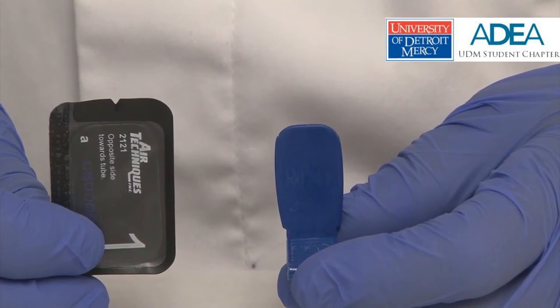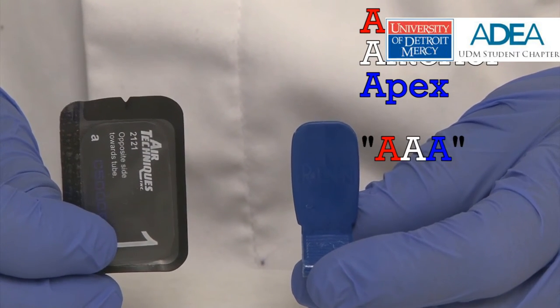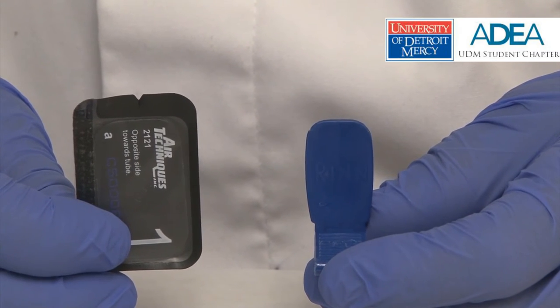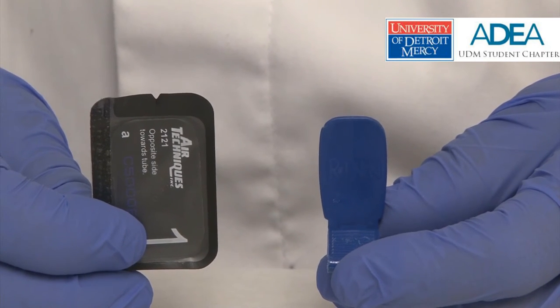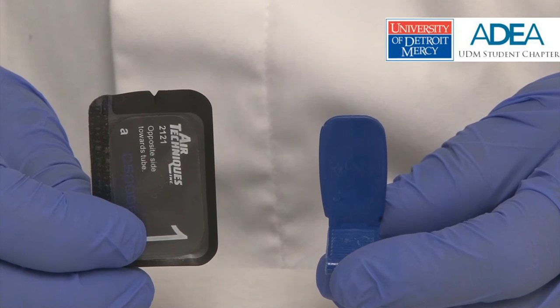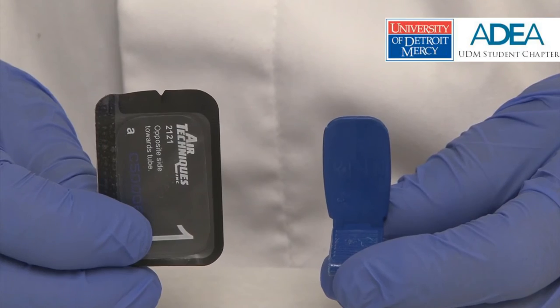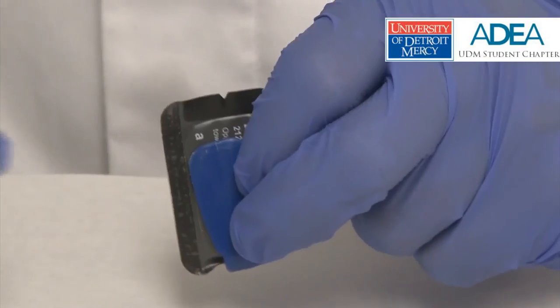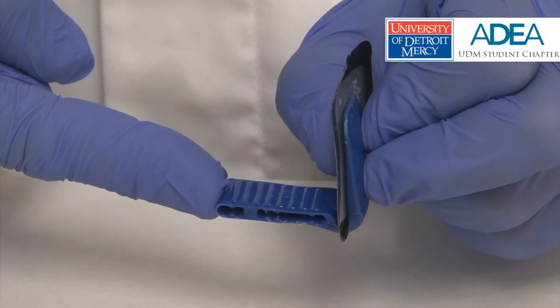I remember a single rule, A anterior apex, like the road service, triple A. In this way, the A is superimposed on the image away from the narrow conical shaped roots of anterior teeth. In addition, the A is not superimposed on the coronal or incisal part of the image, which might interfere with interproximal or incisal edge evaluation on the resultant image. The A is placed in the holder away from the bite stick.